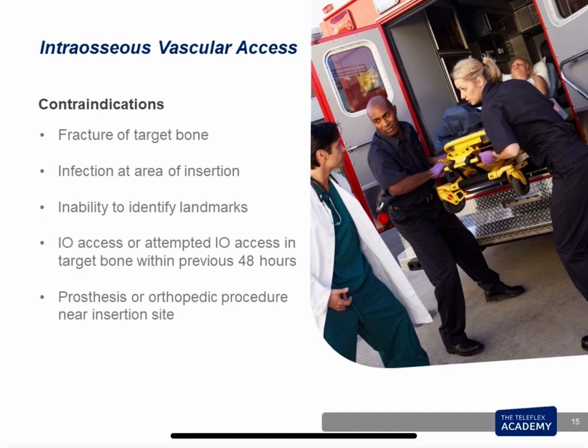IO-access or attempted IO-access within the target bone within the previous 48 hours. So if an IO was either dislodged or an attempt was made to insert an IO and it was unsuccessful, one needs to wait at least 48 hours before reattempting an IO in that same bone.